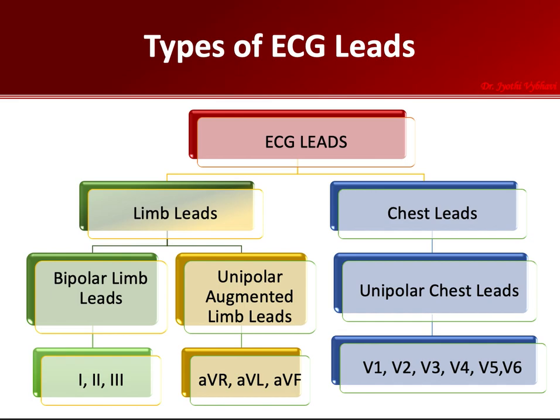Now, as a good student, you should be asking me, why do you need 12 leads? Isn't one lead enough to record the ECG activity? Why should we have so many leads? That's my question.